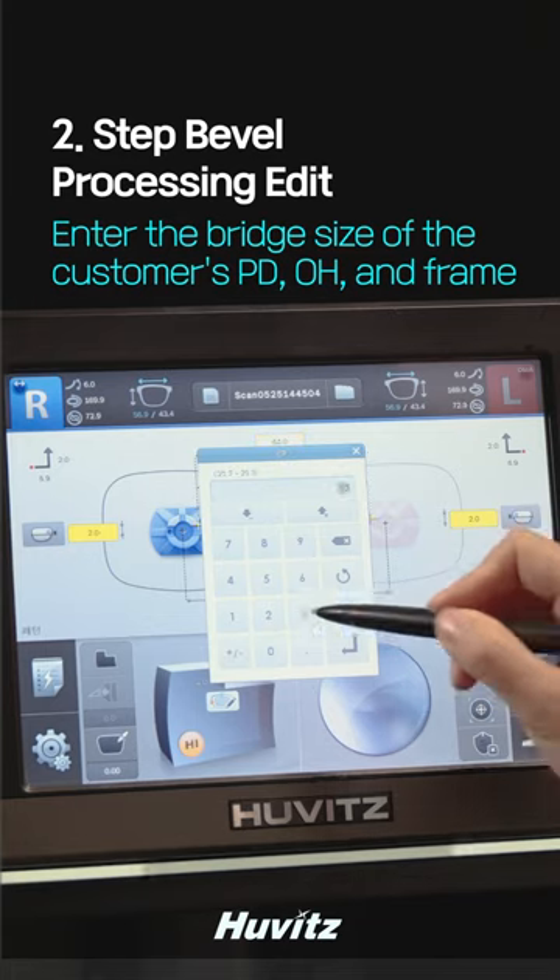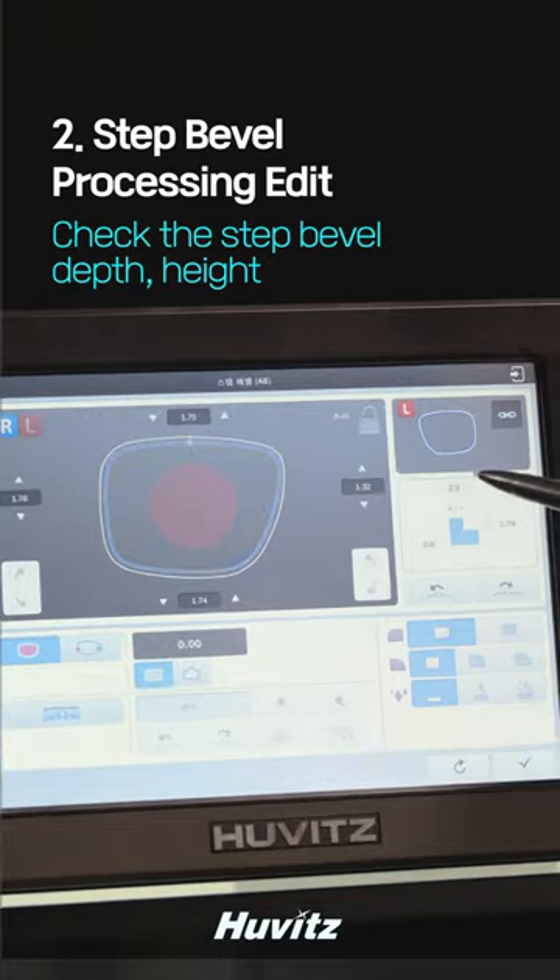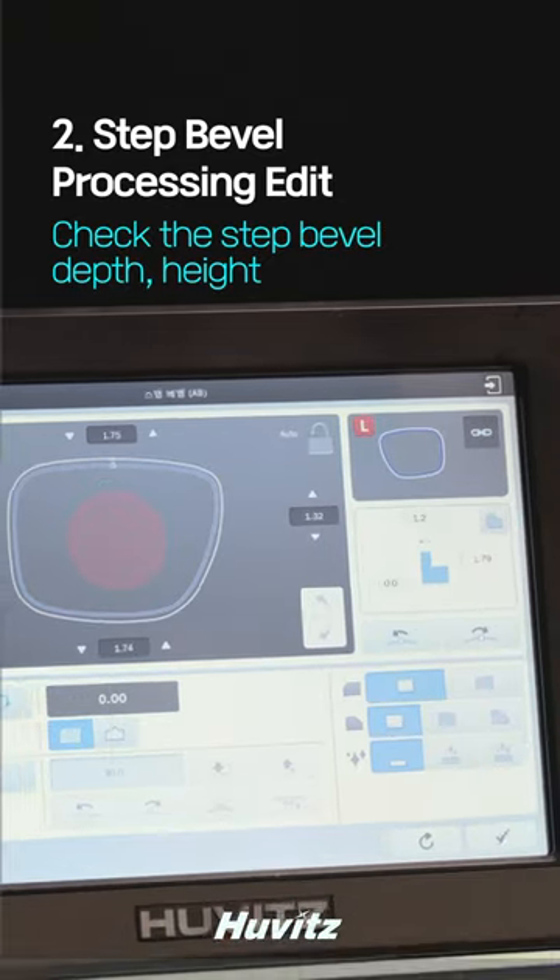Enter the bridge size of the customer's PD, OH, and frame. After clicking on the step bevel editor, check the step bevel depth and enter the thickness of the demo lens as the width of the front of the step bevel.